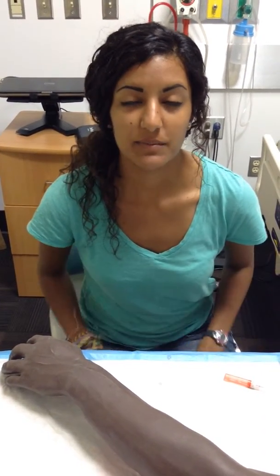My name is Grace Baba and I'm a nursing student at Cedarville University. Today I'll be doing IV insertion and then I will discontinue the IV later. So I begin by entering the room.